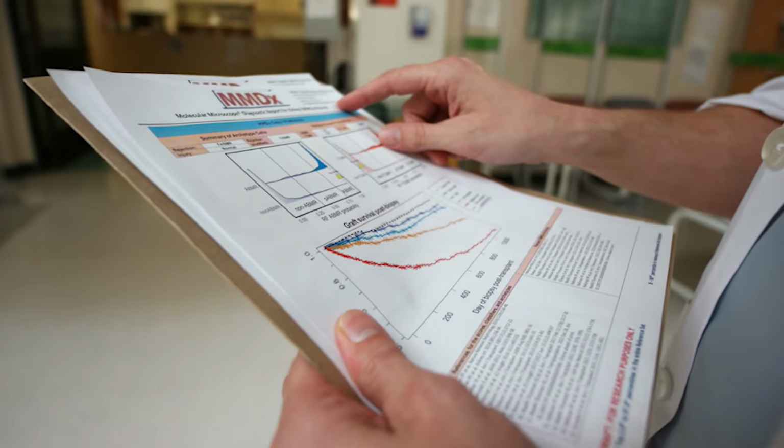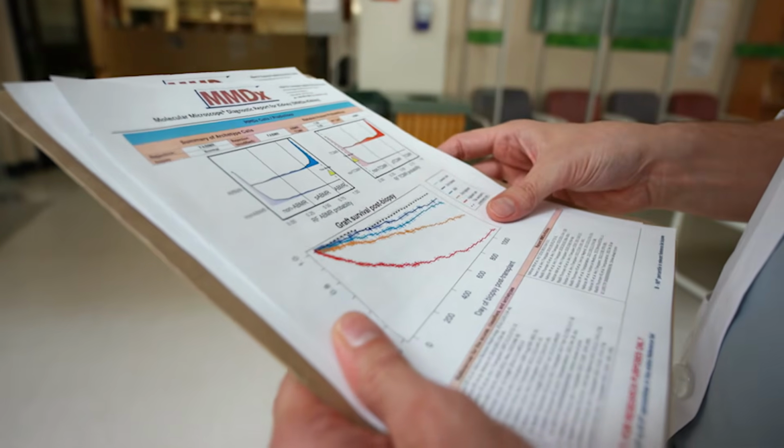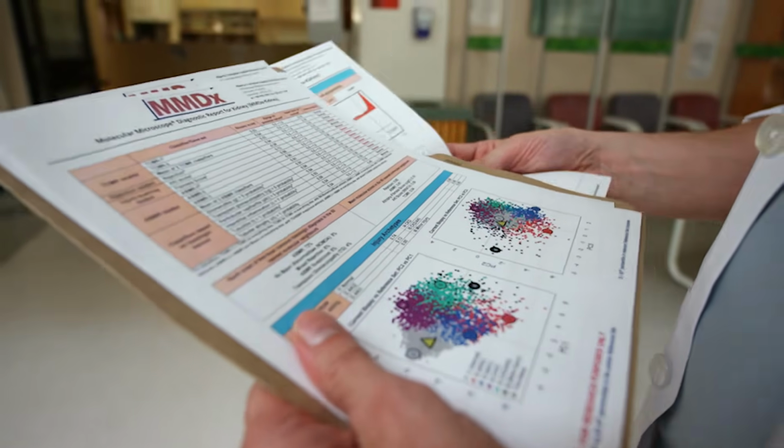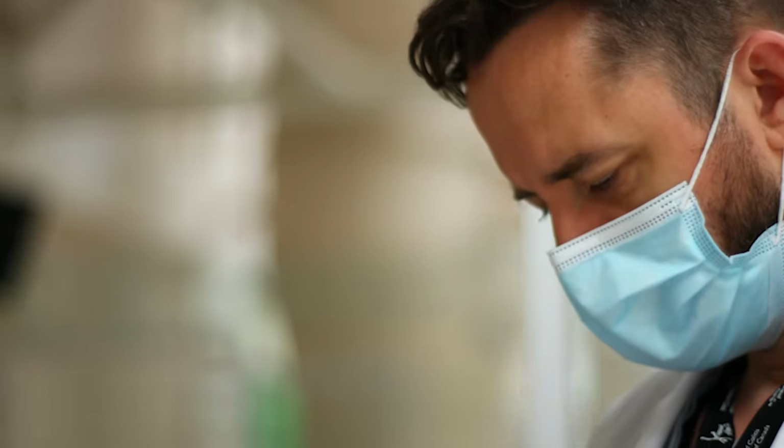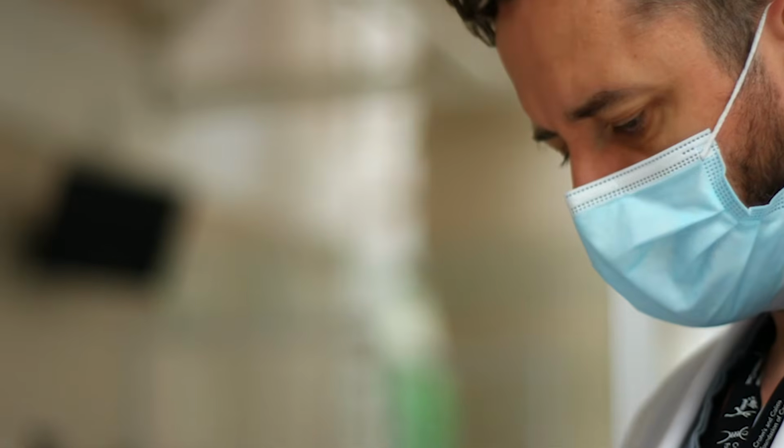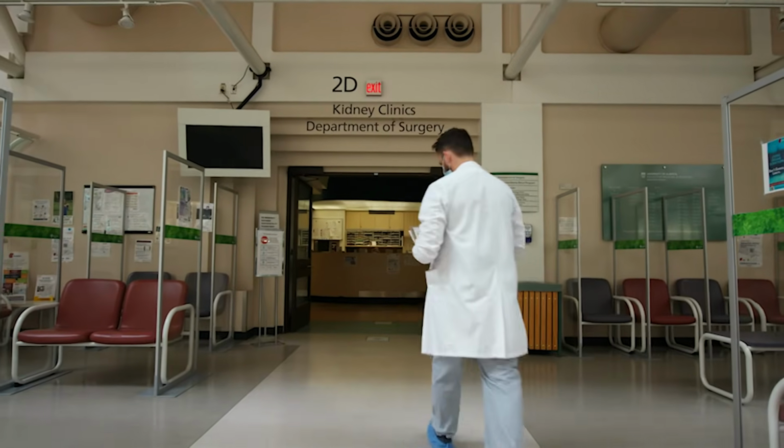The report itself is an ensemble. So it's many different types of scores. Some of those scores in themselves are a consensus opinion, not a single opinion. So they come up on the report, but what they actually are is the median of 12 different opinions predicting if you have ABMR or not.